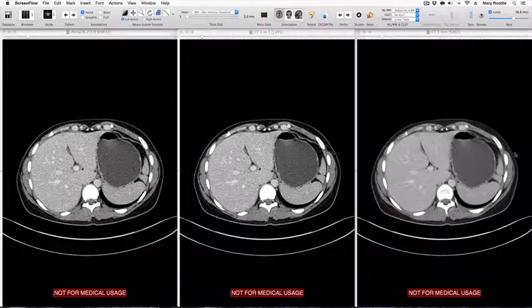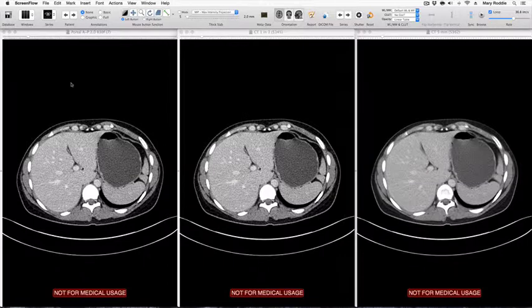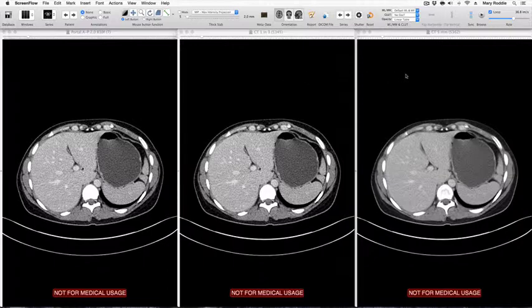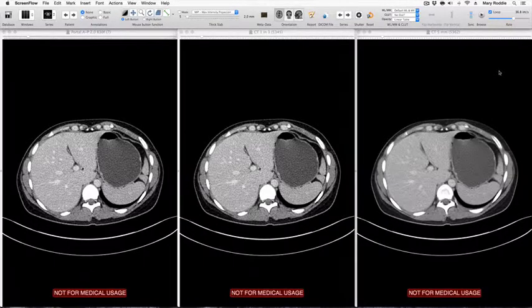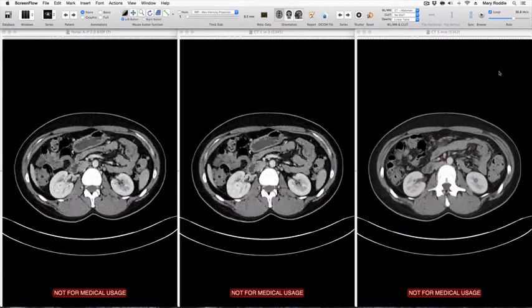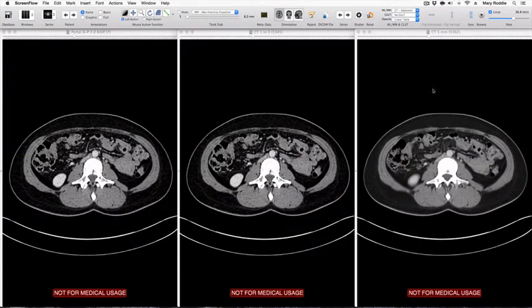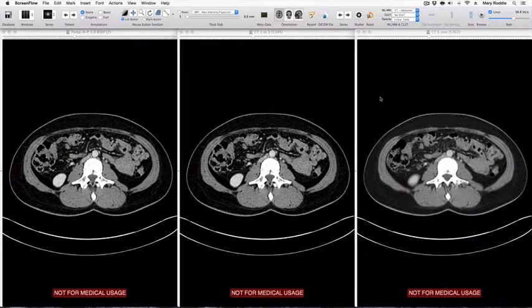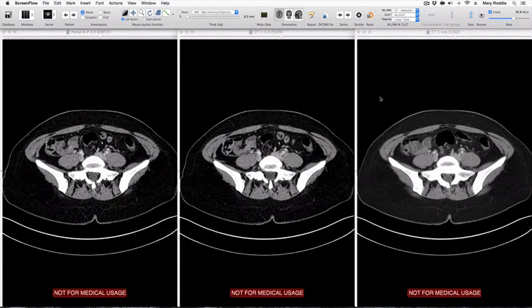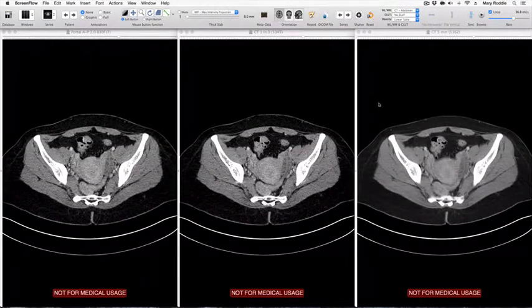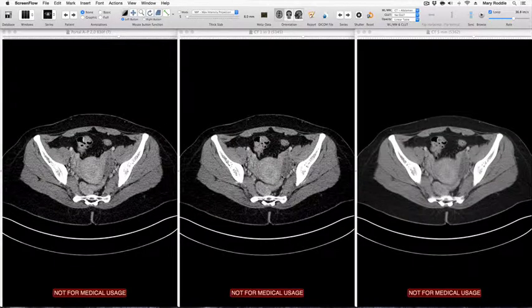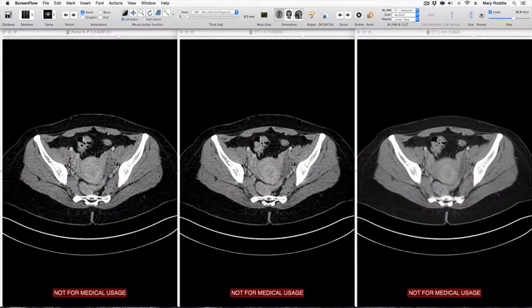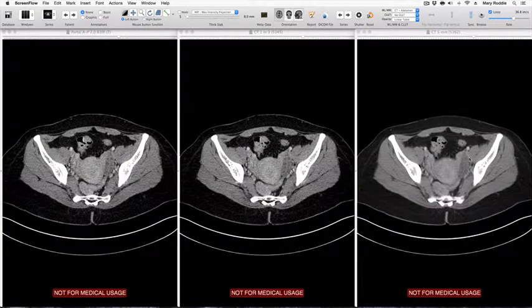Let's compare these images side by side. We have the original series on the left, we have the 1 in 3 series in the middle, and we have the 5mm slice thickness on the right. If we scroll through these you will see there is very little difference in resolution between the original series and the reduced number series, but there is clearly reduced resolution in the 5mm slice thickness. I think you can see this particularly well when you compare this polycystic ovary which looks identical on these two series but we have lost resolution here.